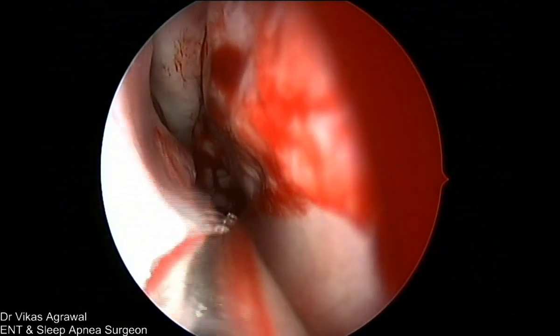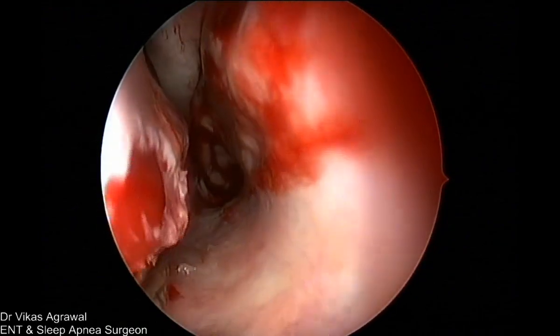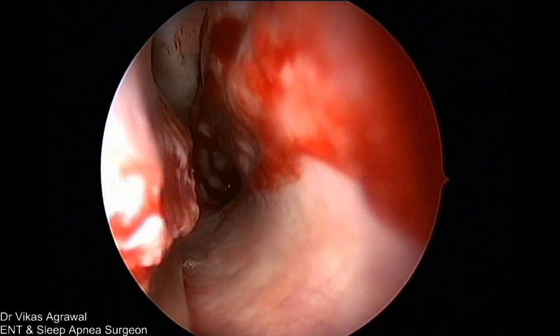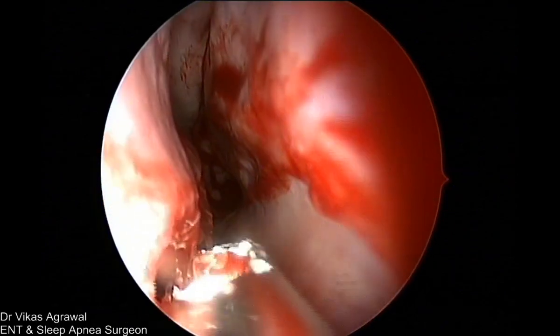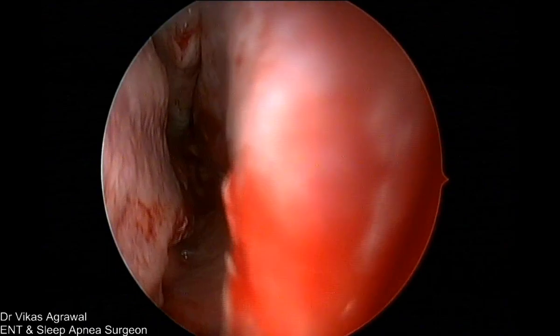There will be some bleeding. We don't have to bother about the bleeding because we have not injected also. So injecting adrenaline is more of a trouble. And see how much of this space is open. Give me the coblation wand.